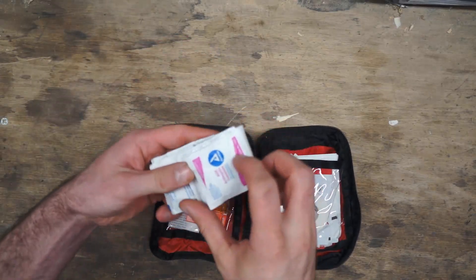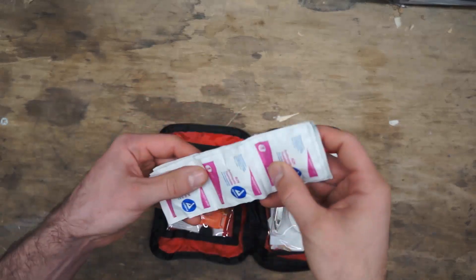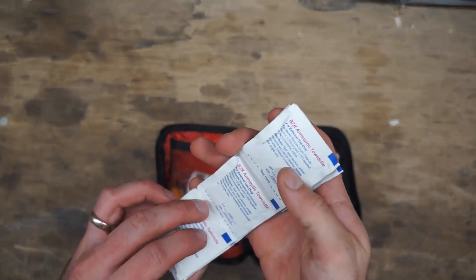On this side we have a lot of antiseptic towels and alcohol swabs — nine of them total, so you have plenty to go a long way.